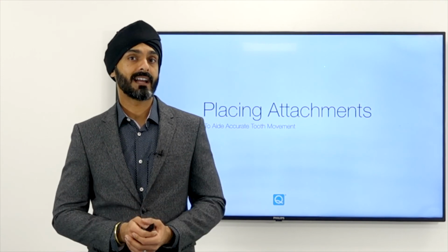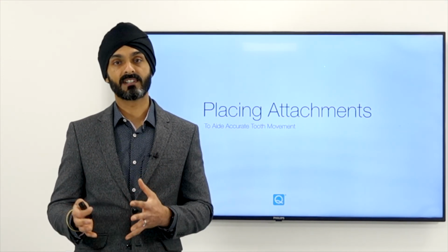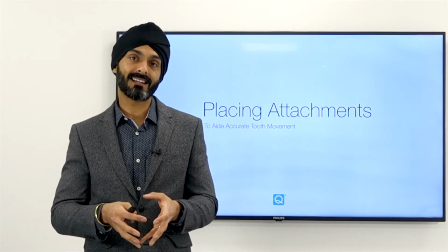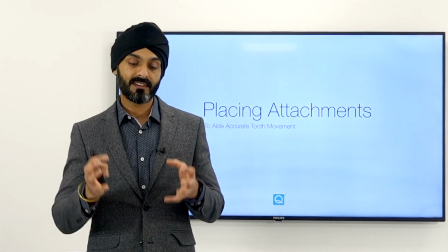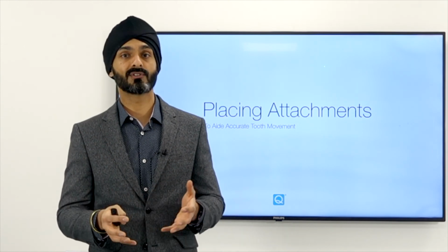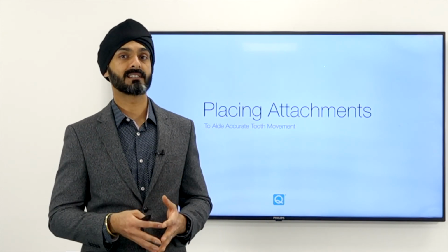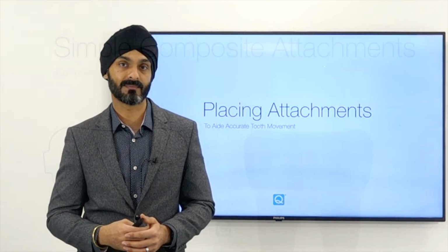So now let's look at placing attachments. Attachments are used for a number of reasons, but the most important reason is to get a better mechanical lock between the aligner and the tooth itself. This will improve the effectiveness of your aligners, and it will let you carry out certain tooth movements which are almost impossible without attachments. In addition to this, it's also going to improve the retention of the aligner in the patient's mouth.